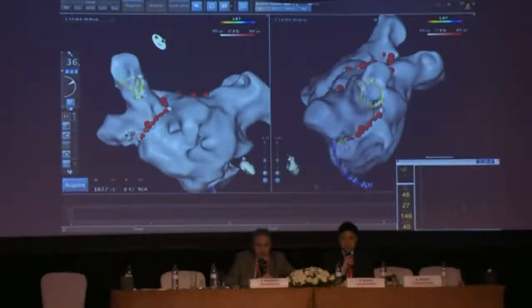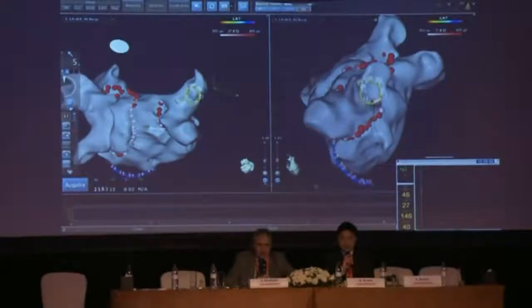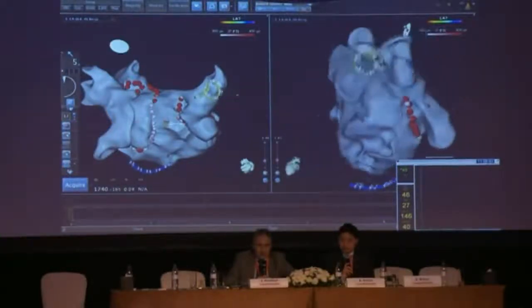That's very nice. Richard, can you update us on your normal ablation parameters for your WACA lines? I saw 30 watts being delivered, anteriorly mainly and posteriorly. So you use 30 watts? I do throughout, just simply because I keep forgetting to change the power. But I use the force time integral now to go softer on the back wall and harder on the front wall.